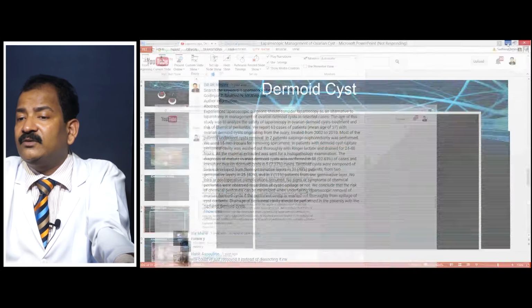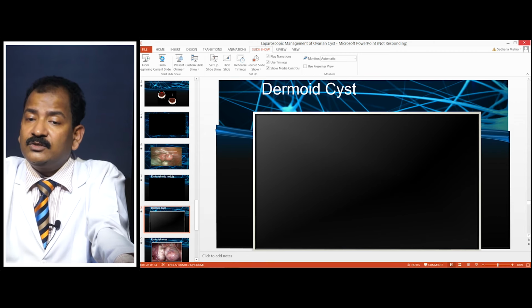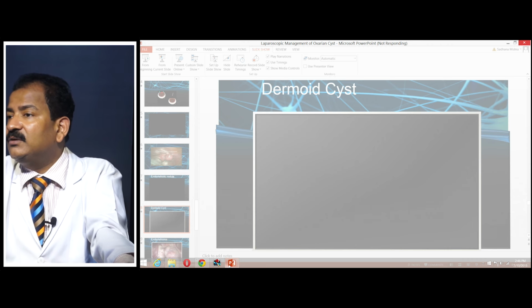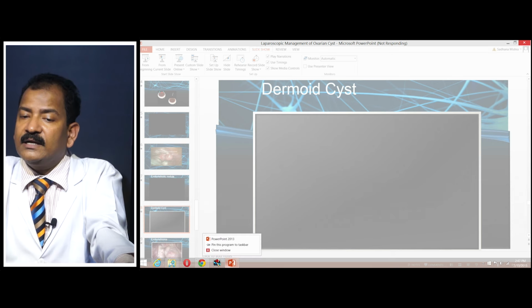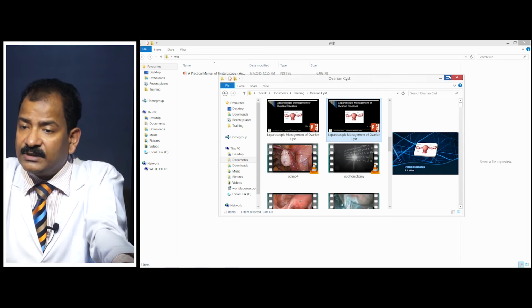Laparoscopy, if you are thinking that you can operate the same way as you open, it is not possible. So, I have just pasted it. After that he says that okay, rupture it. But you know, to stop the mouth of your enemies or competitors, it is always recommended that you keep one endo bag. But in spite of having the endo bag there, you cannot guarantee that the fluid will go into the endo bag. It may not go there and it may spill outside. So, we never have a 100% guarantee that it will not rupture.